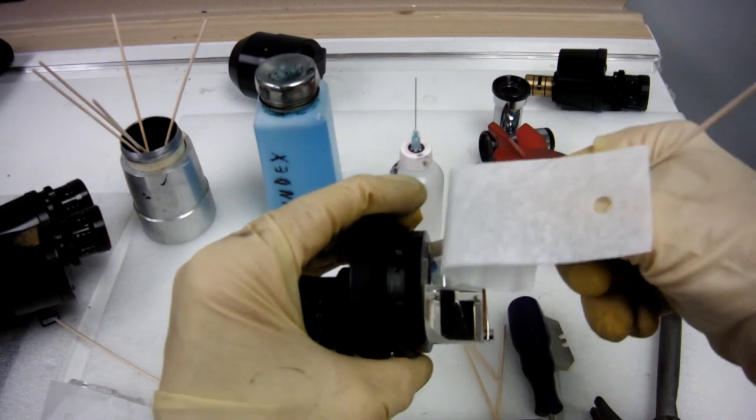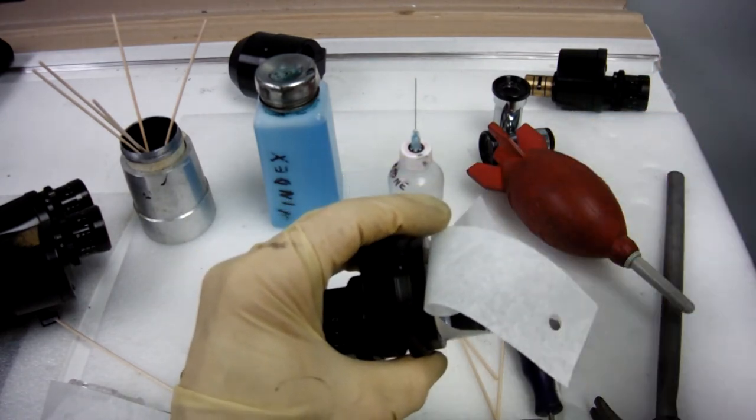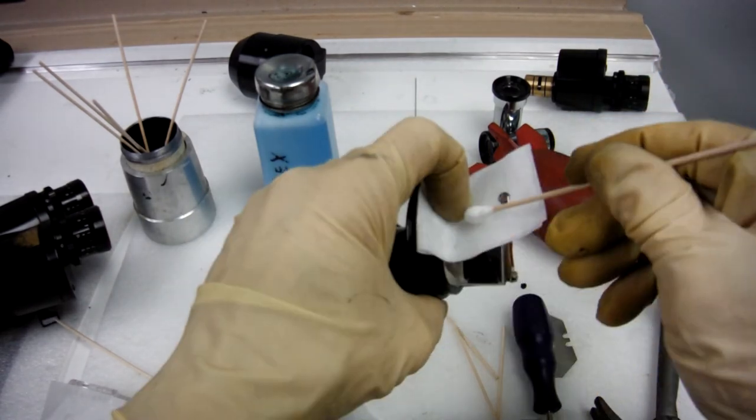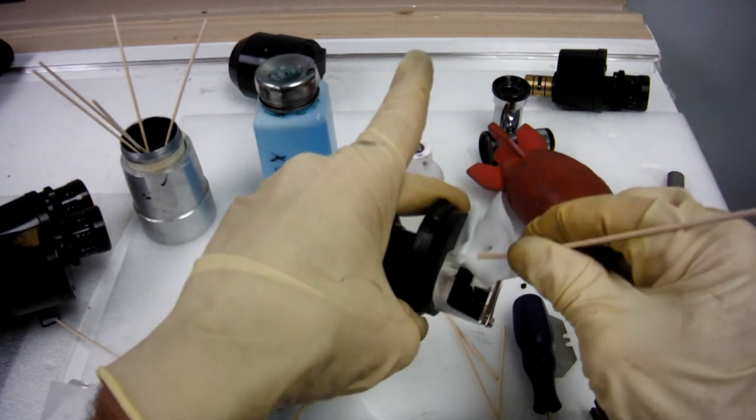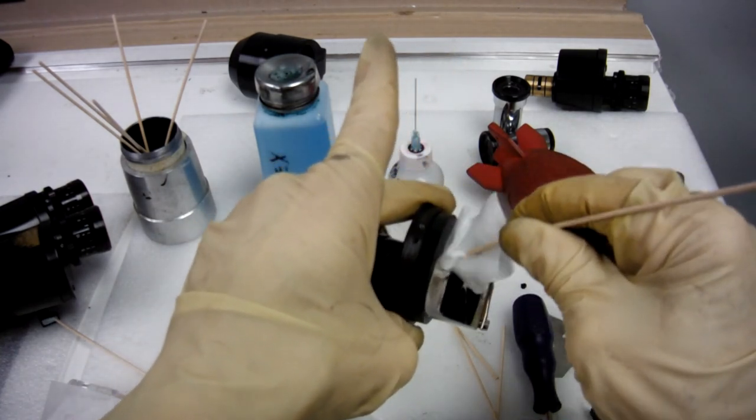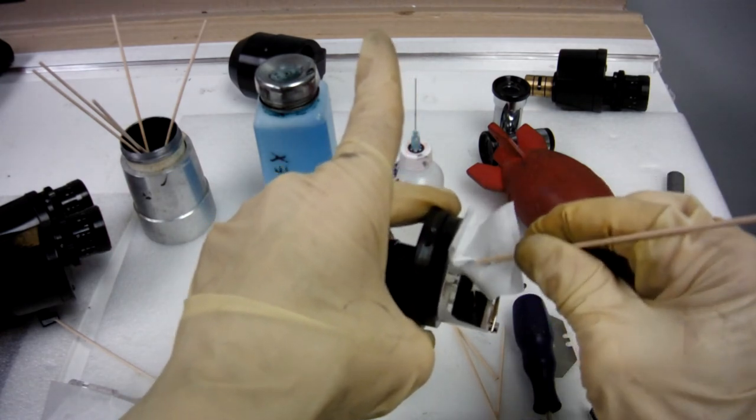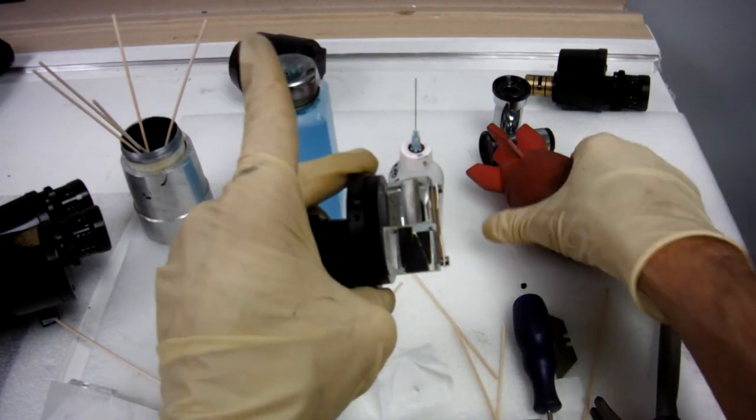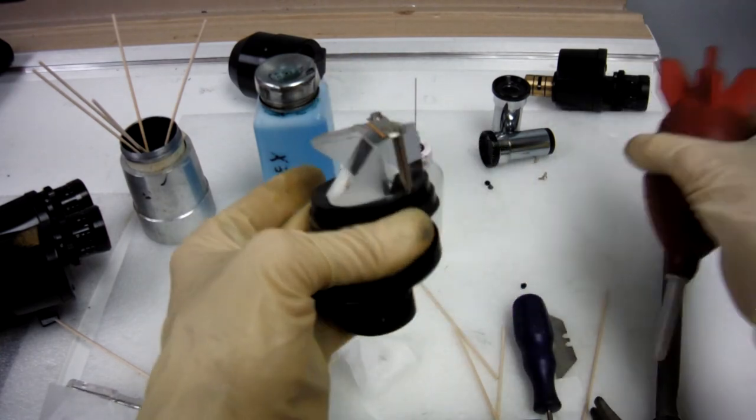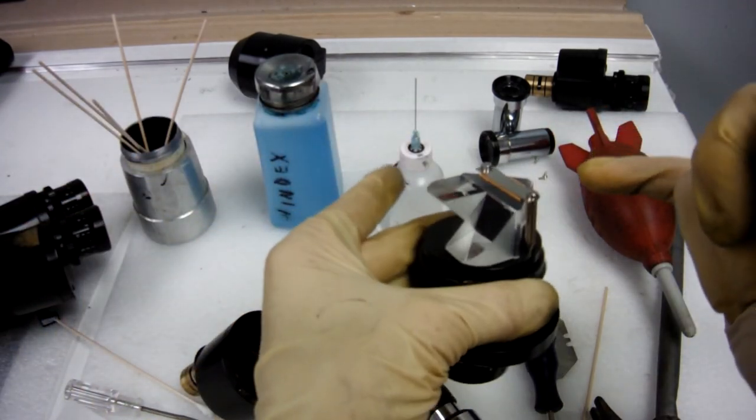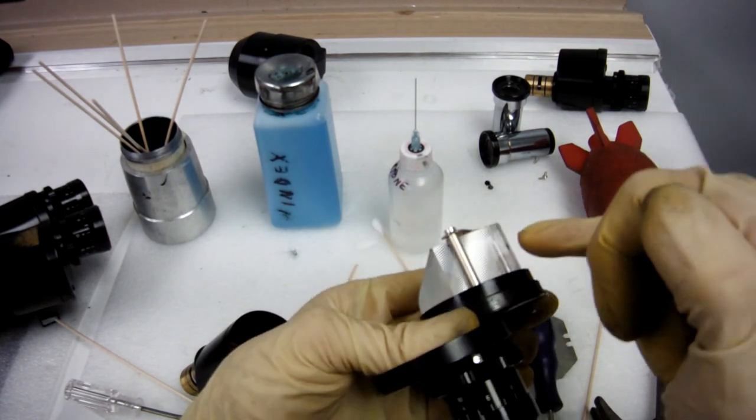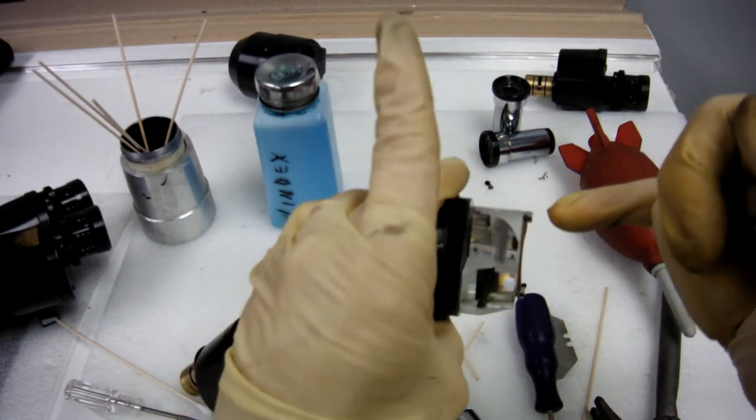Once again, you can use your chin rest paper. Use that paper to get down way deep in that little crevice, and if you clean every prism surface that you can see in there.